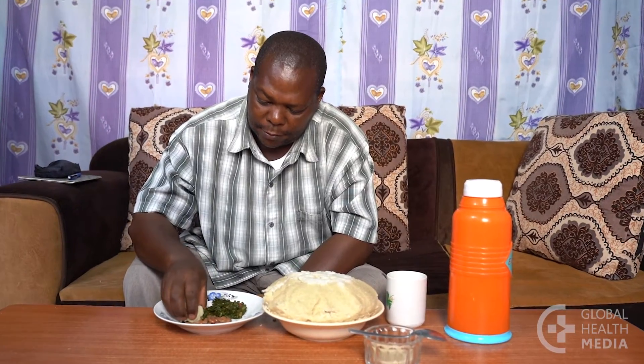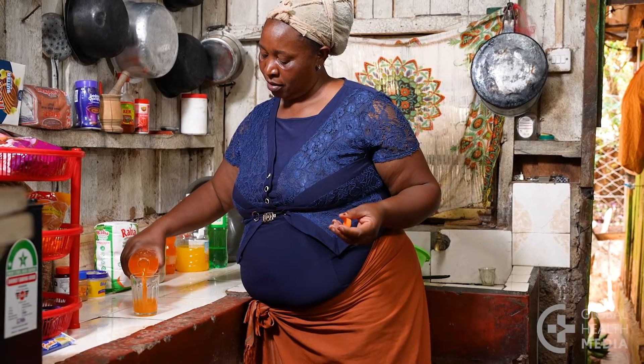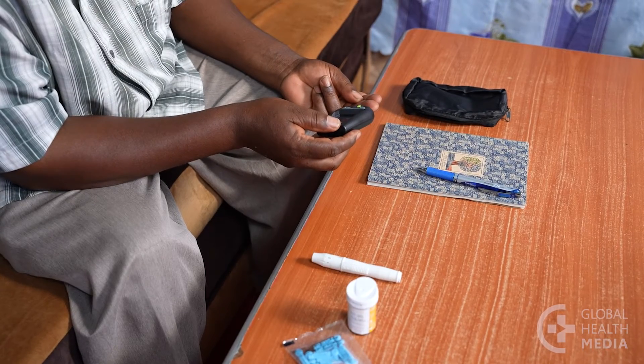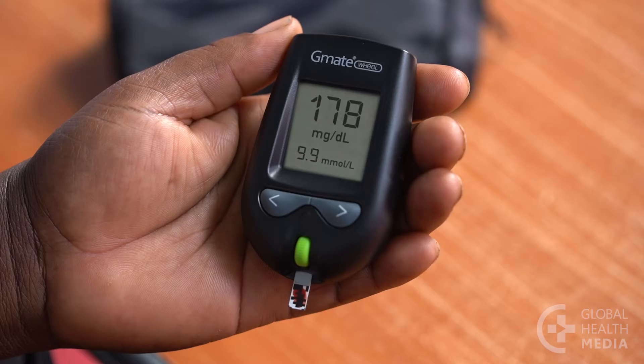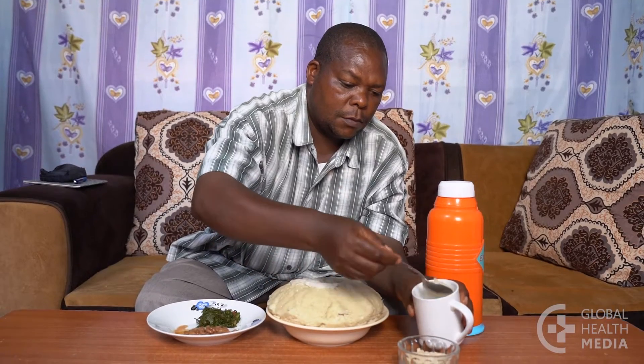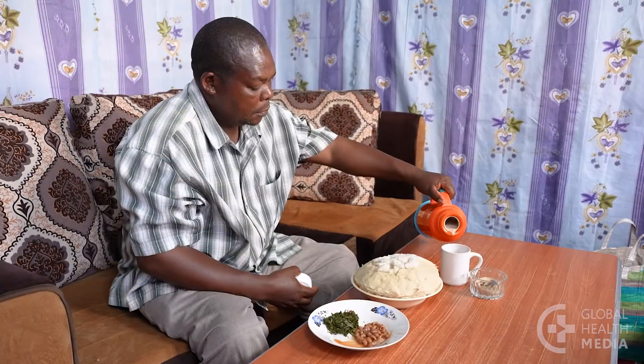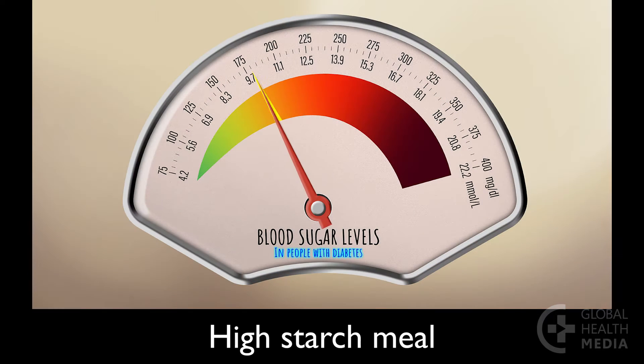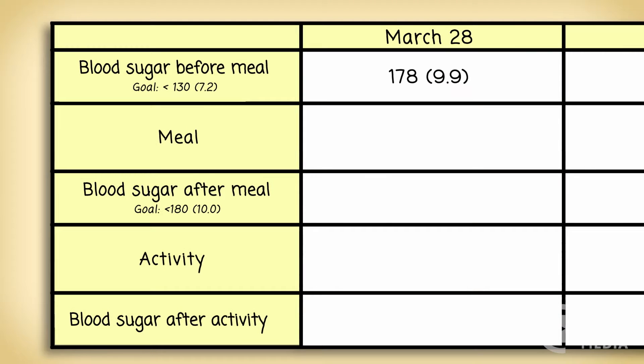Start with meals you normally eat. You can also test favorite foods or drinks that you think are a problem. Measure your blood sugar before your largest meal of the day. Eat and drink what you normally would. Two hours after you begin eating, measure your blood sugar. The blood sugar level is very high after eating this high starch meal and far above the goal. Write the details in your record.